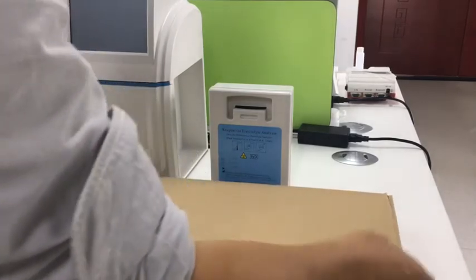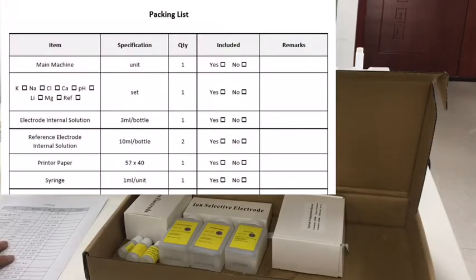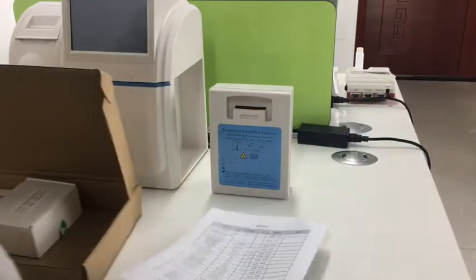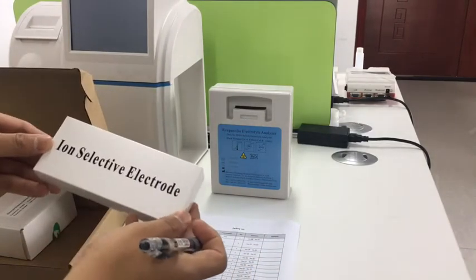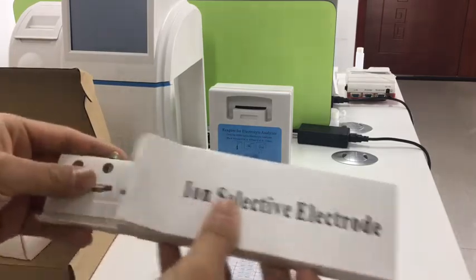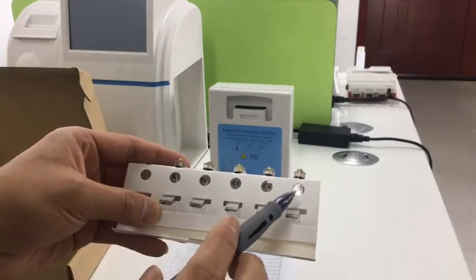Then we can open the accessory box and take out the packing list. We can use a pencil to check each accessory, reagent and other items. For example, we take out the normal electrodes and show them to the end users to check each one: potassium, sodium, chloride, pH and calcium.